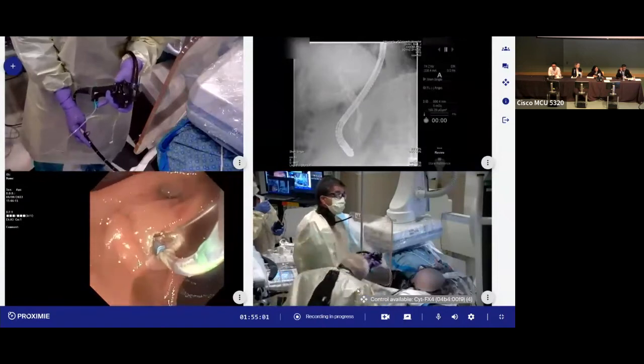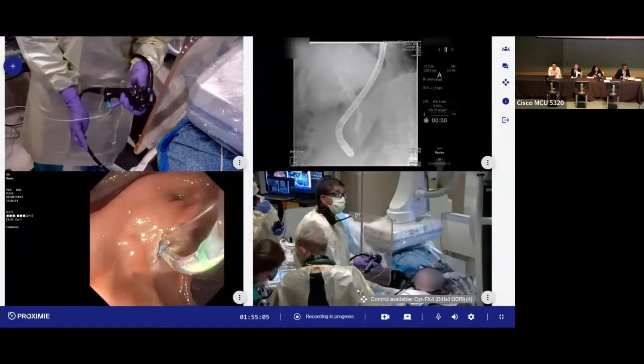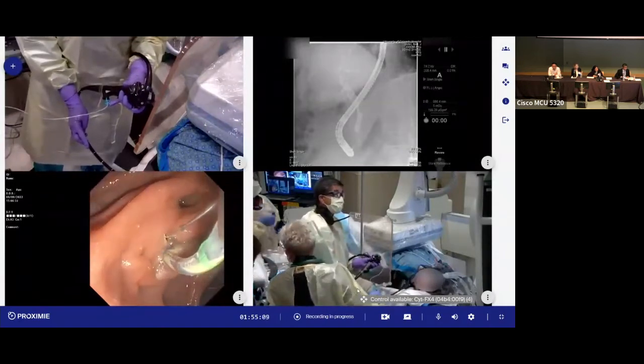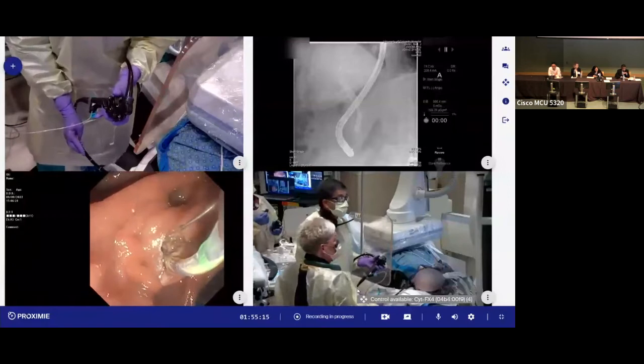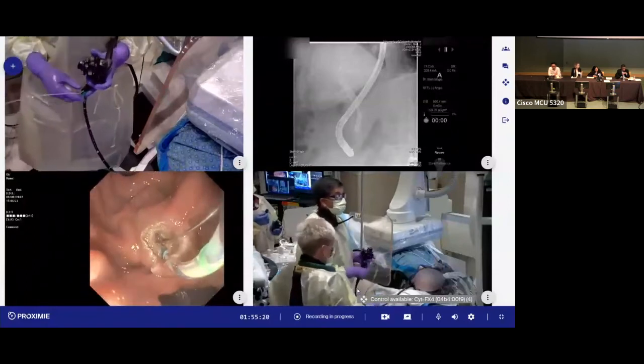And what's your opinion about a partial sphincterotomy, 50% of the transmural fold? I guess it's a pretty subjective question. Does that sound reasonable? Yeah, I guess just enough room for the balloon to expand and hopefully not tear through the wall.